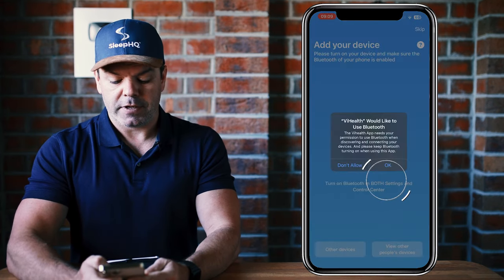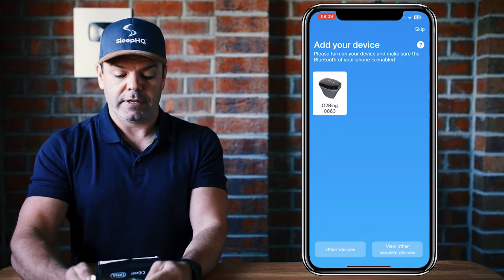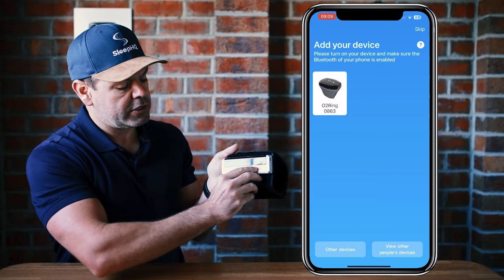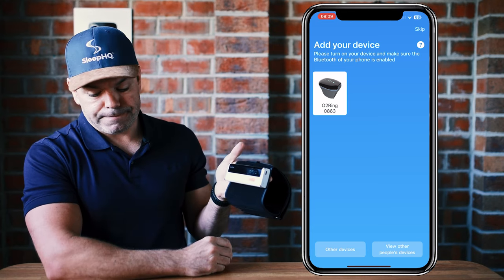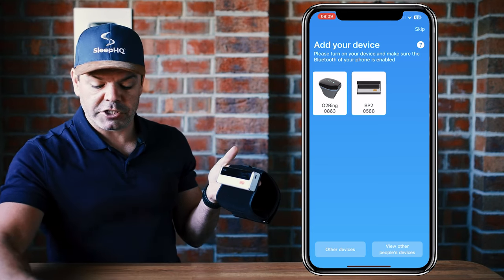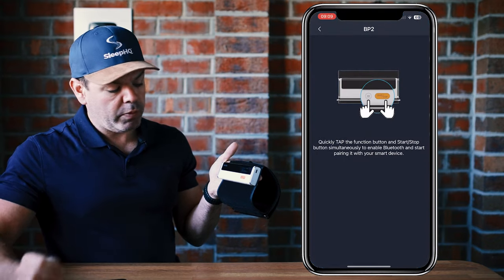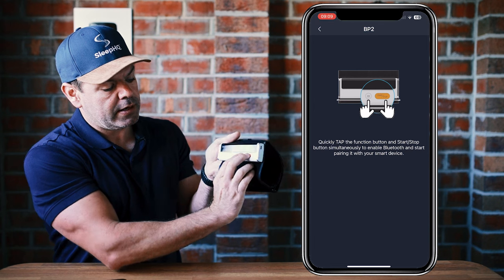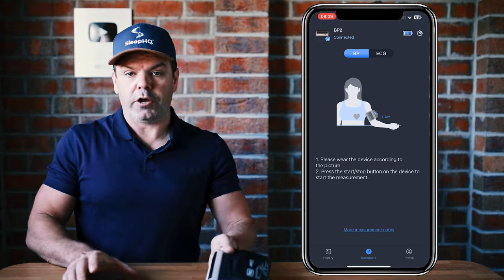Select guest mode. ViHealth will ask to use Bluetooth — click OK. Then it says add your device, so just make sure your cuff is on, hit the button to turn it on. You can see the cuff showing up on the phone — click it. Then tap the two buttons simultaneously and you can see it's connected and we're good to go.